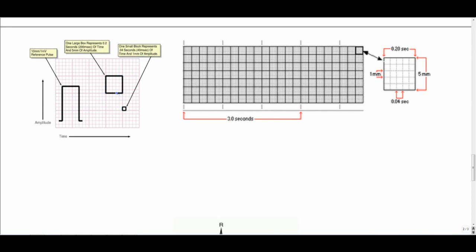Each large box consists of 5 small boxes and thus is 200 milliseconds in length. Again, length is measured in milliseconds or seconds and height is measured in millivolts. Very key in understanding EKGs to know how big these boxes are and what they represent.